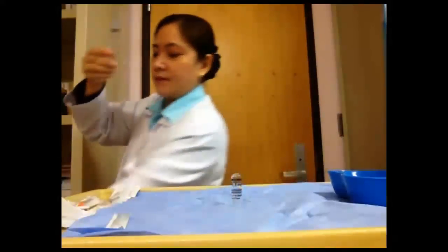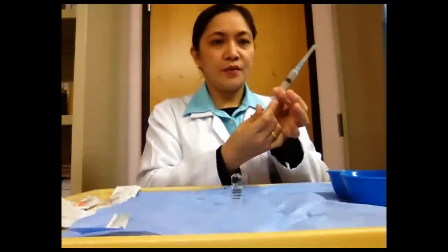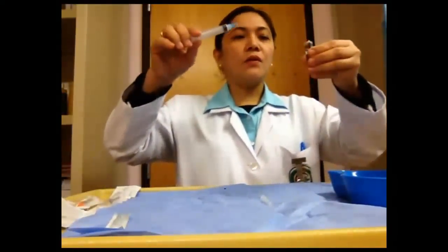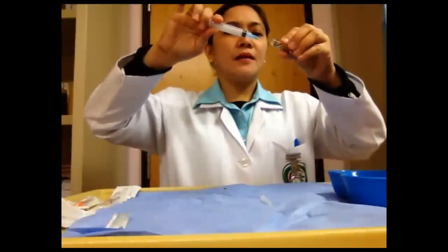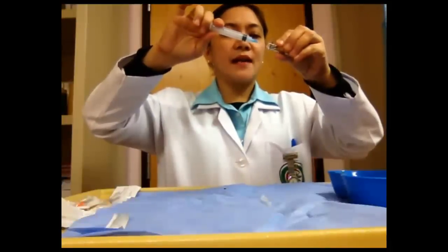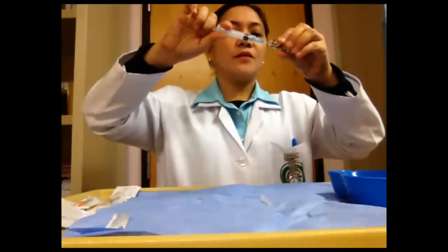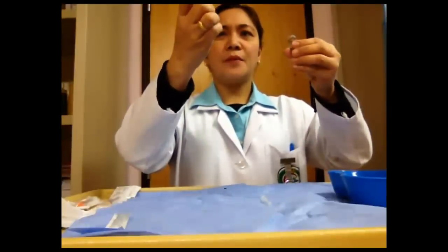Then get your syringe with a needle. Secure the needle. Loosen the plunger, because usually a new needle or a new syringe has a tight plunger, so you have to loosen it, and then remove the cover. Hold the ampule at your eye level and insert the needle inside the ampule without touching any side of it, and get the desired amount of medication. If you need 1 ml, then get 1 ml of medication from the ampule.